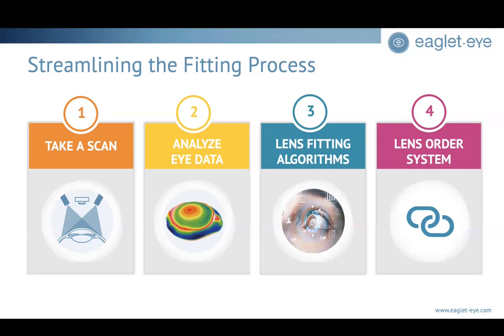To be honest, when I have patients in the clinic, I will spend most of my time, especially in the beginning, talking about their goals, figuring out what they're needing and doing the higher level processing and thinking, because my staff are trained to take the data and know how to use a first lens fit. I've already given them instructions on a lens that I'm interested in using, and they'll pull starting lenses from stock even before I have to spend my time doing that.